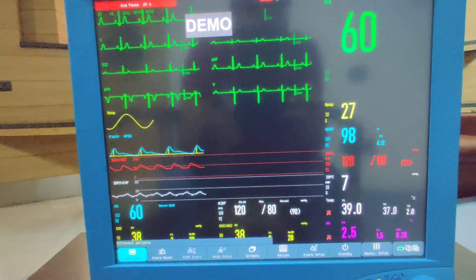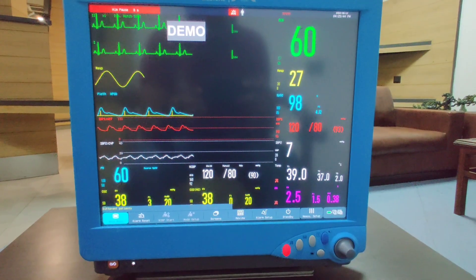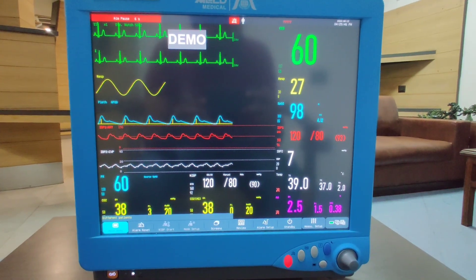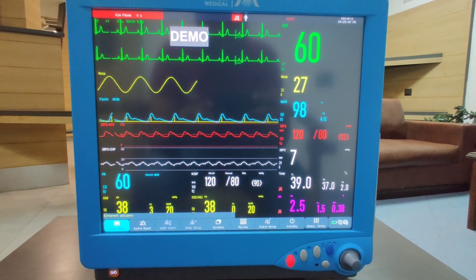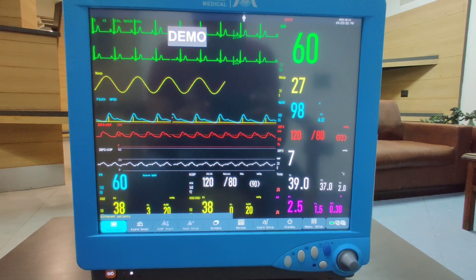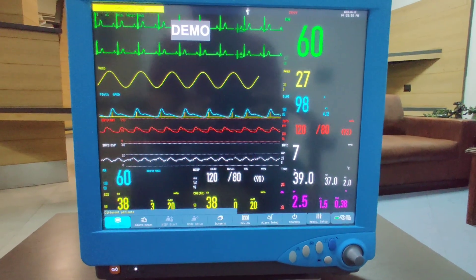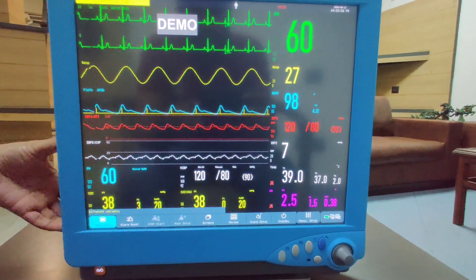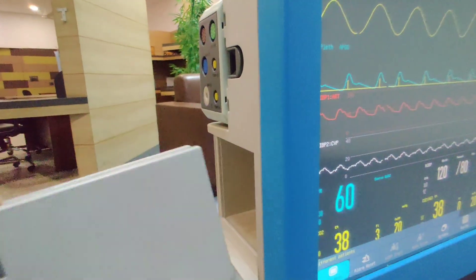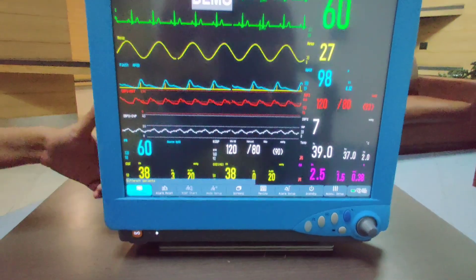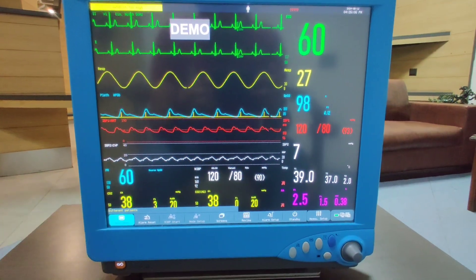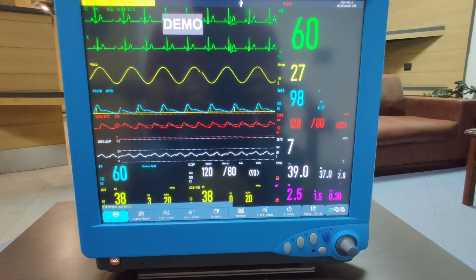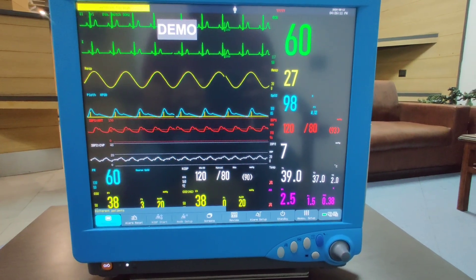This monitor is upgradable to any advanced parameters monitoring like IBP, NMT, AGM, ETCO2, and cardiac output. You only have to purchase the cassette on the left side like this. The software is already built in, so you just have to buy the cassette or the upgradable module for that particular parameter and it can be updated.